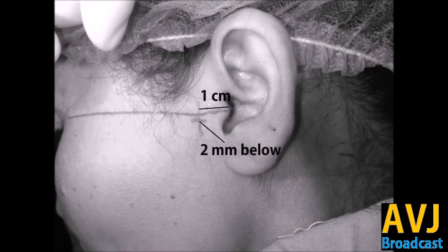First of all, draw an imaginary line from the mid of the tragus up to the lateral orbital rim. At the lateral orbital rim you have to hit the point where the Whitnall's tubercle is almost palpable inside the rim. This is the place where the lateral canthal ligament gets attached.